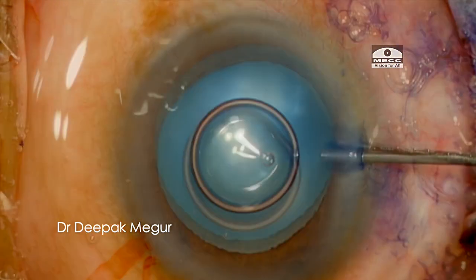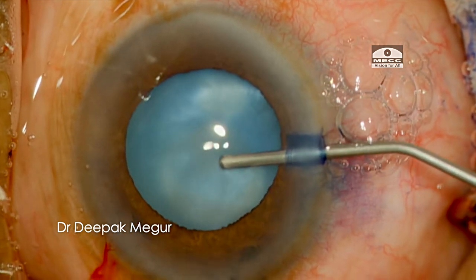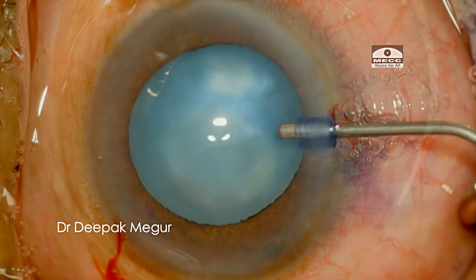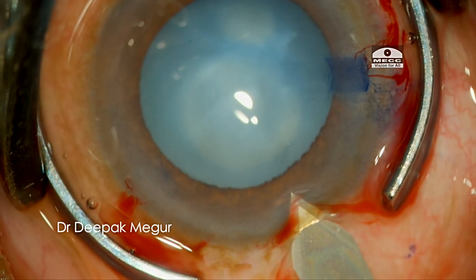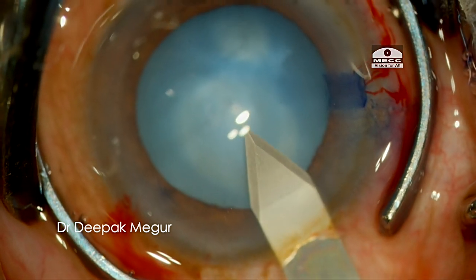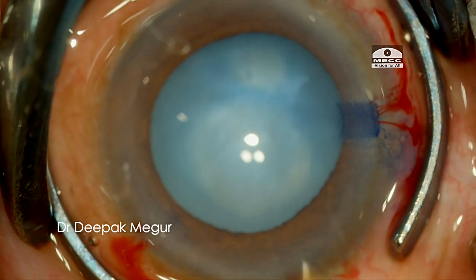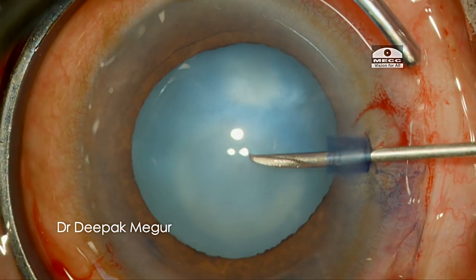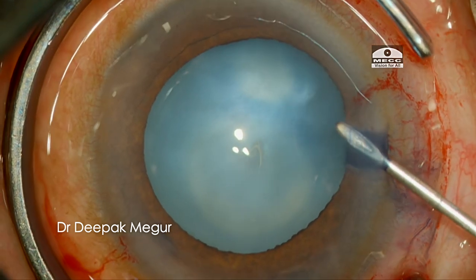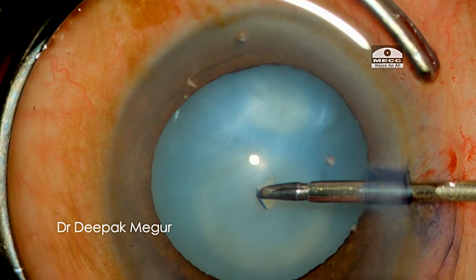After staining the anterior capsule, I am using dispersive OVD to fill the chamber. As soon as we puncture, I don't see any fluid escaping, again confirming that the cortex is more jelly-like.